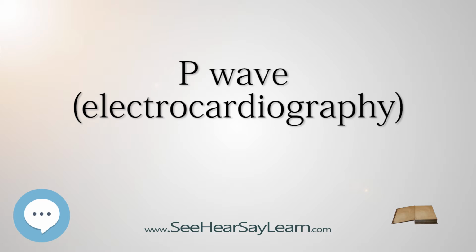as P waves. Absence of the P wave with a flat baseline may indicate fine atrial fibrillation, or sinoatrial arrest with a secondary escape rhythm. If P waves are not clearly delineated in the surface ECG, a Lewis lead may be used to better visualize P waves.